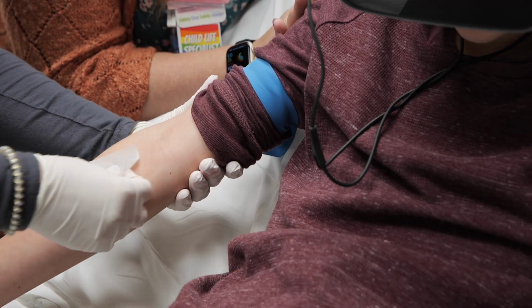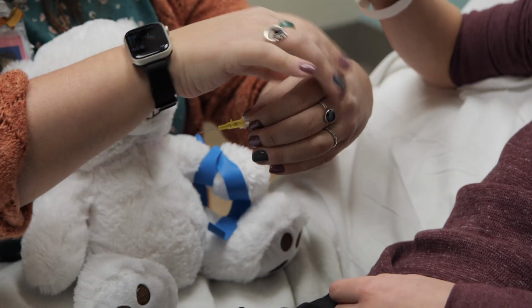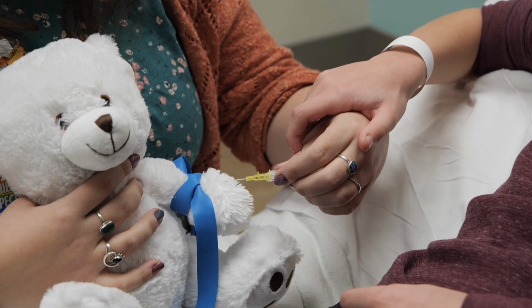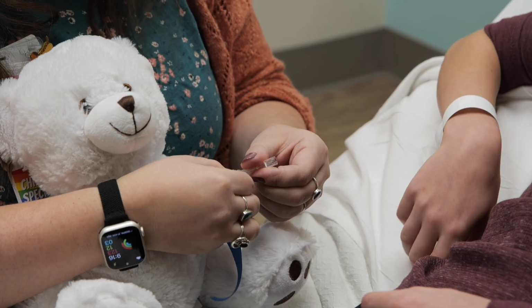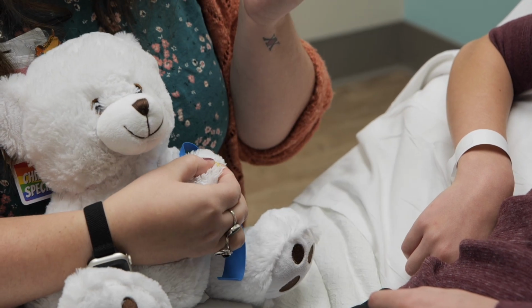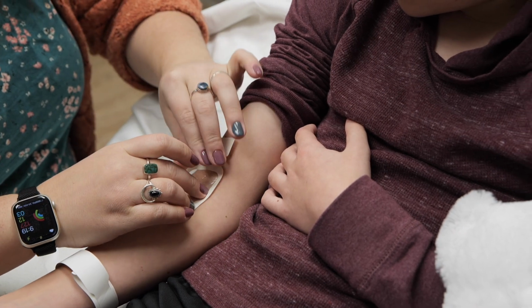Some patients need something called contrast before getting their pictures taken by the MRI. Contrast helps the doctor see what's inside your body in a better way. You get the contrast through an IV. An IV is a small plastic straw that goes into your vein to help your body quickly get medicine or a drink of water. When you get your IV, your one job is to help your arm stay calm and relaxed to make it as easy as possible.